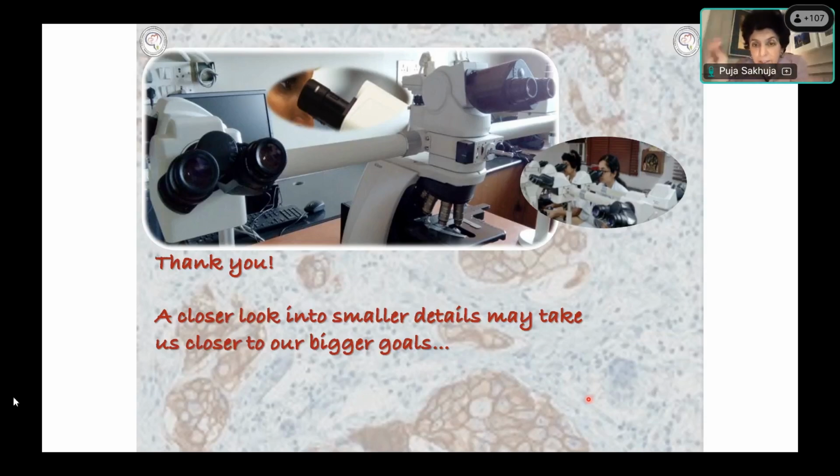If it is a patchy disease, that means some fragments show disease, some don't, then it is again more likely to be Crohn's, not UC. Finally, granuloma. If you see granuloma, then of course you have to look carefully at the granuloma.